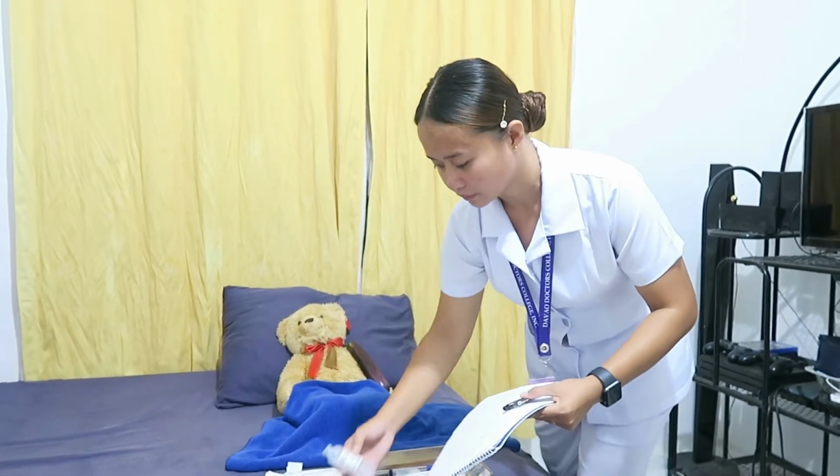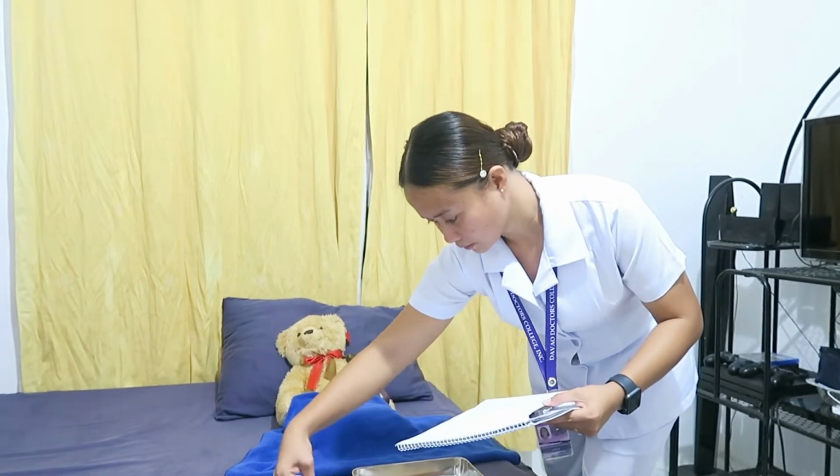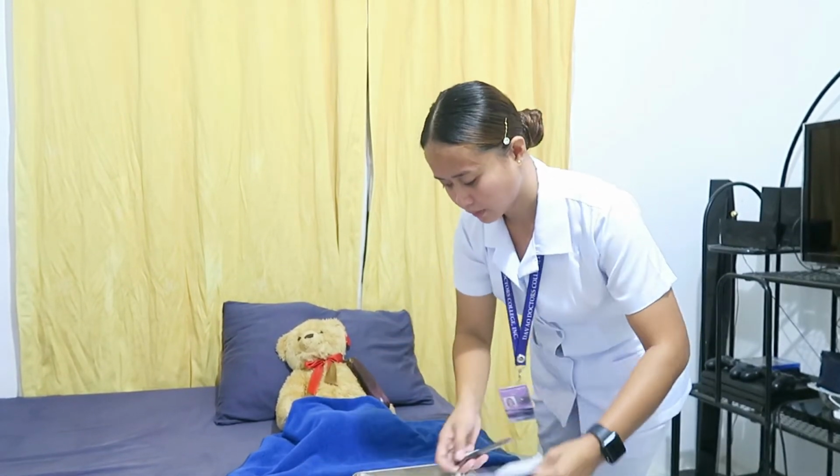After that, check the label of the medication. Now that I am done checking the doctor's order, let's proceed to follow the 3 checks for administering medication. First, read the label on the medication when it is taken from the medication card. Second, before withdrawing the medication. And the third is after withdrawing the medication. So let's proceed to the next procedure.